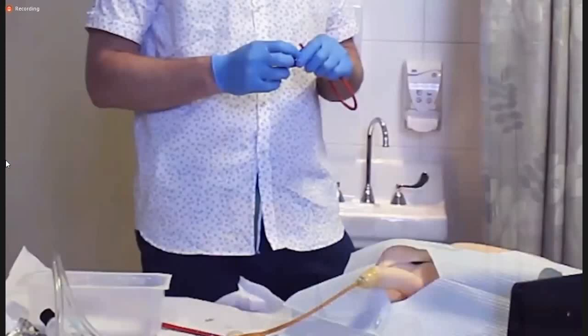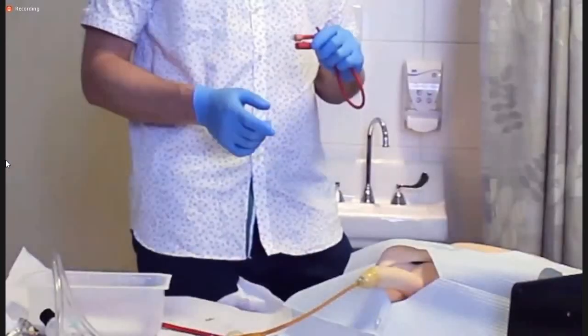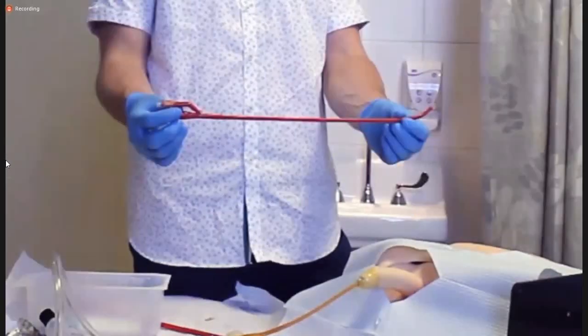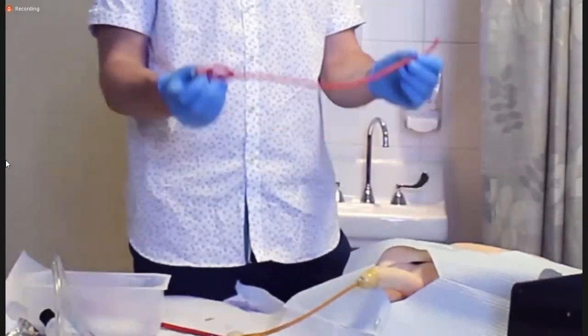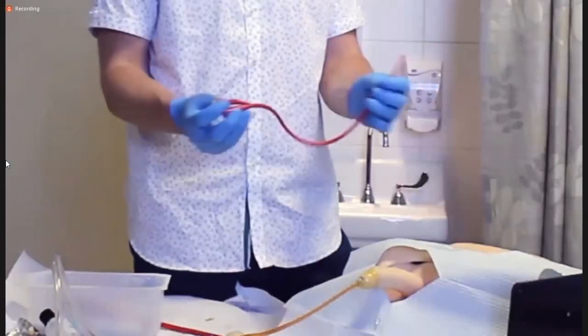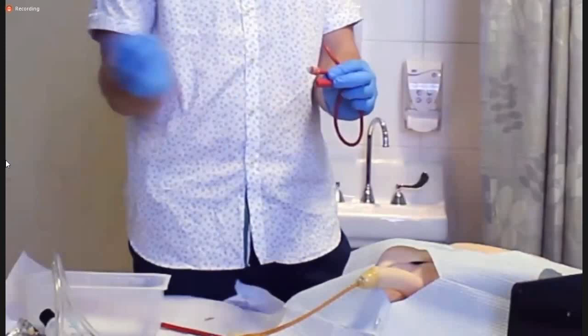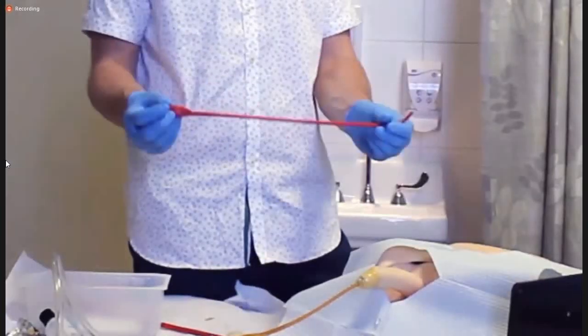So if somebody you suspect has prostate enlargement, you can try a coude tip catheter to negotiate through the prostate with the tip pointed up. And in some cases, it may be very helpful to use a larger catheter, because a big prostate may require a little bit more pressure to negotiate the catheter through those large lobes.